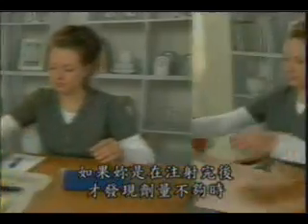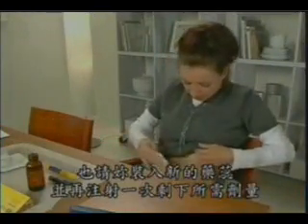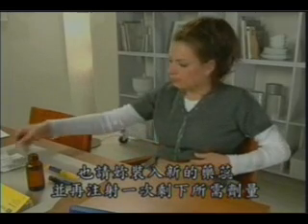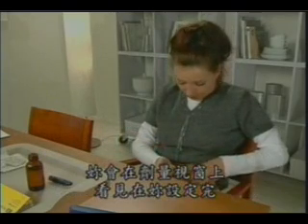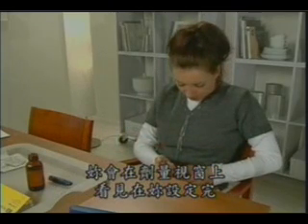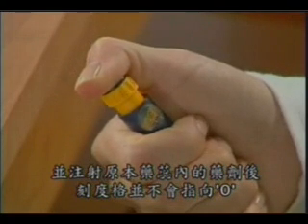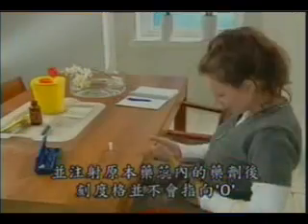If you realize too late, in other words, after starting the injection, that you do not have enough Puregon in the cartridge, you must also take the remainder of the dose from a new Puregon cartridge. You will see that the dosage scale does not go all the way to 0 after setting and injecting the prescribed dose. The number in the dosage window will not read 0.